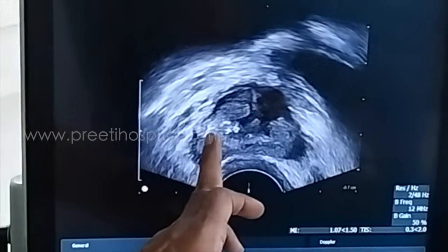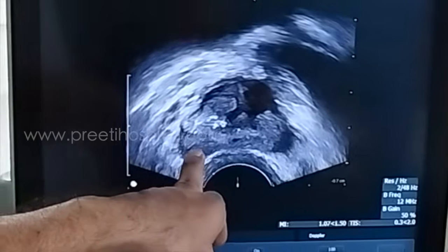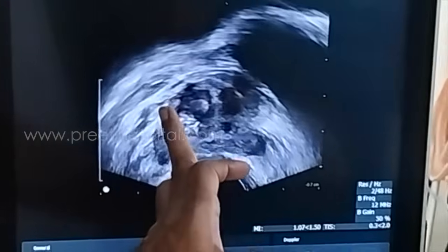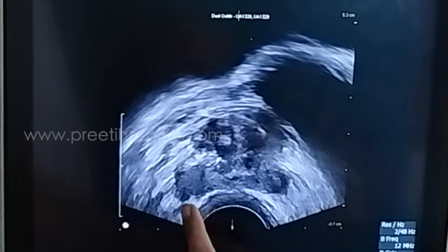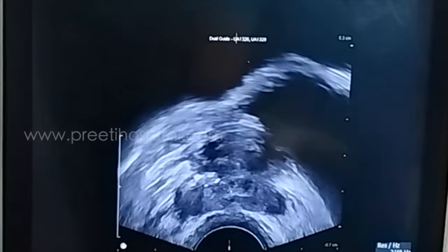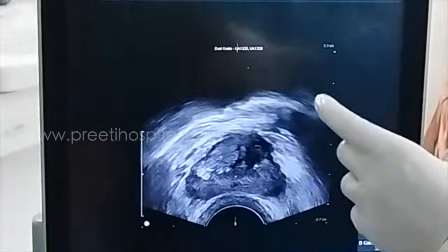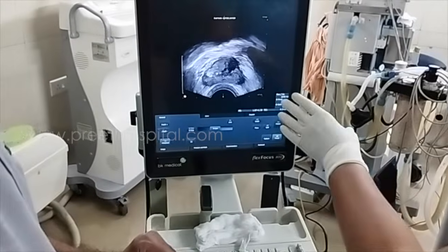Then why do you need a sagittal section? For example, if I take a biopsy of these two peripheries in axial cut, like what we do in monoplanar, does it have any disadvantage? The length of the peripheral zone will be much bigger in case of side firing, as we get in sagittal view.